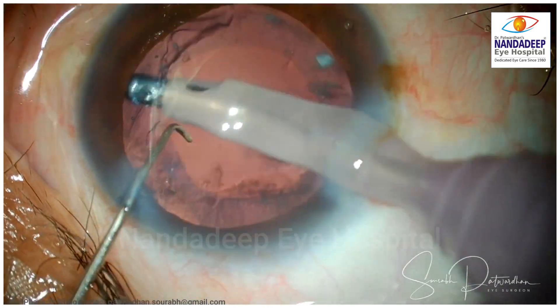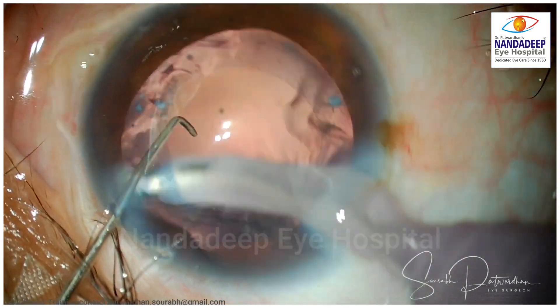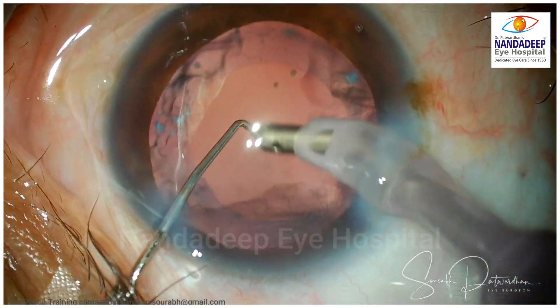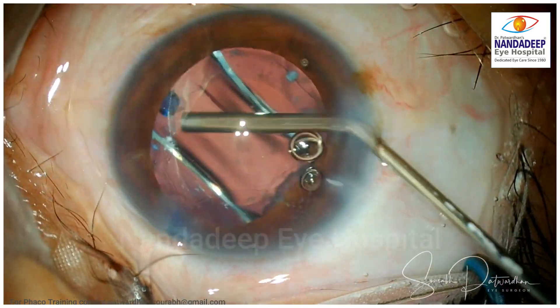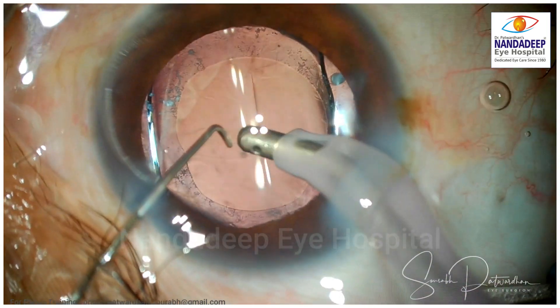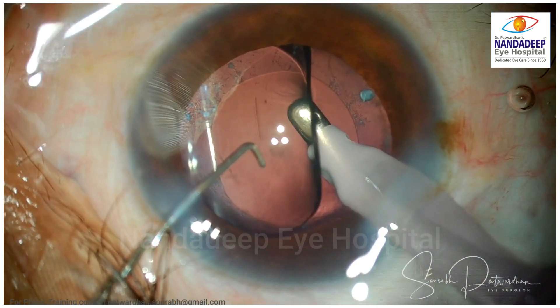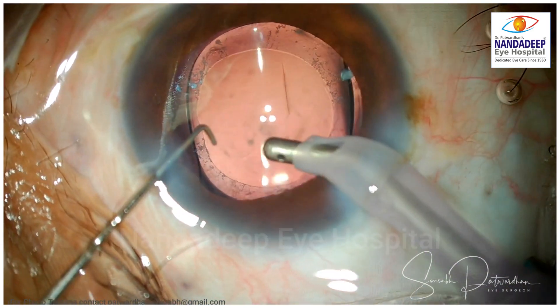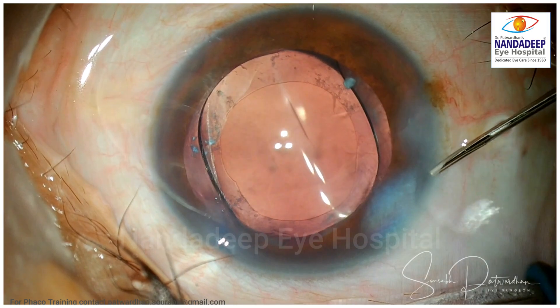That is the end of the emulsification. The cortex aspiration — there is very little cortex because most of it is already liquefied; just a little bit of tags remaining which you can take out. In case you find weaker zonules, we can implant a CTR prophylactically. Otherwise, in this case you can see the zonules are quite strong and I can place the IOL in the bag. Good centered rhexis is there. If the CCC is too small, I would have enlarged the rhexis by taking a tangential nick and then enlarging using the forceps, but here it looks quite good. A hydrophobic IOL in the bag — and that's a case well done.